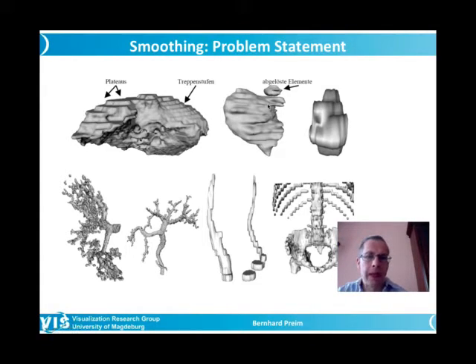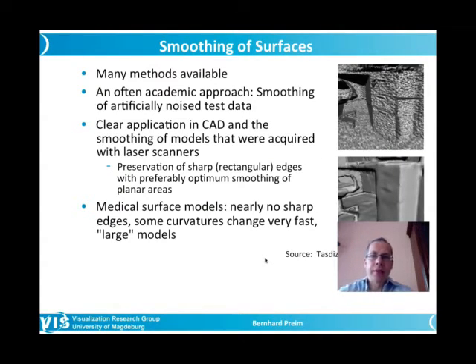So this problem cannot be solved. We discussed this problem in the last lecture, namely the situation that an elongated structure that is not exactly in the axial direction, there is a risk that this is shown as a separate surface, because marching cubes assumes overlapping projections in the individual slices.